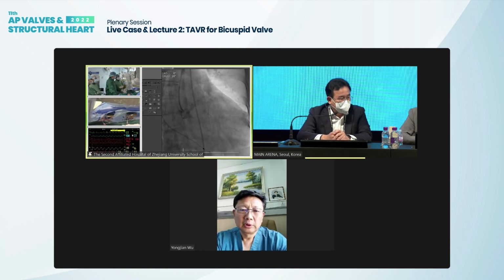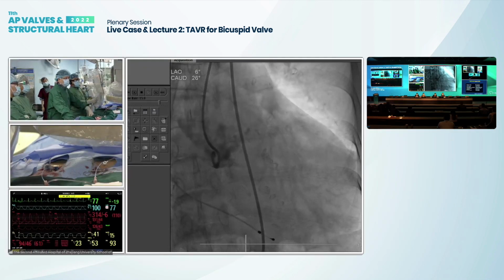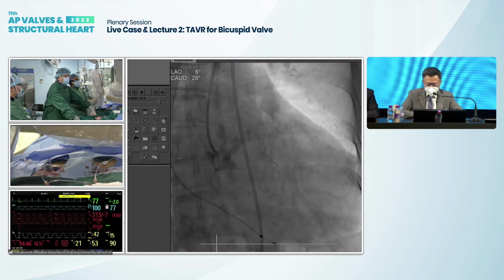So since the video transmission is good, we let you do the procedure. Go ahead, Dr. Wang. Just go ahead and do the procedure. Hi, sorry, the transmission is temporarily interrupted.